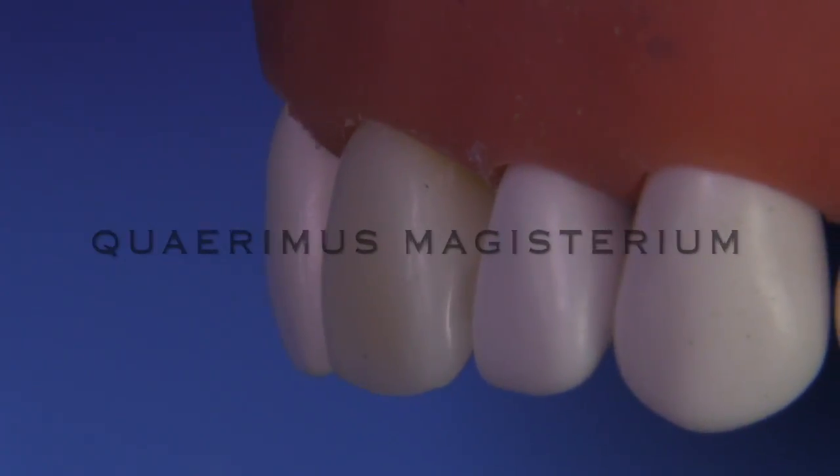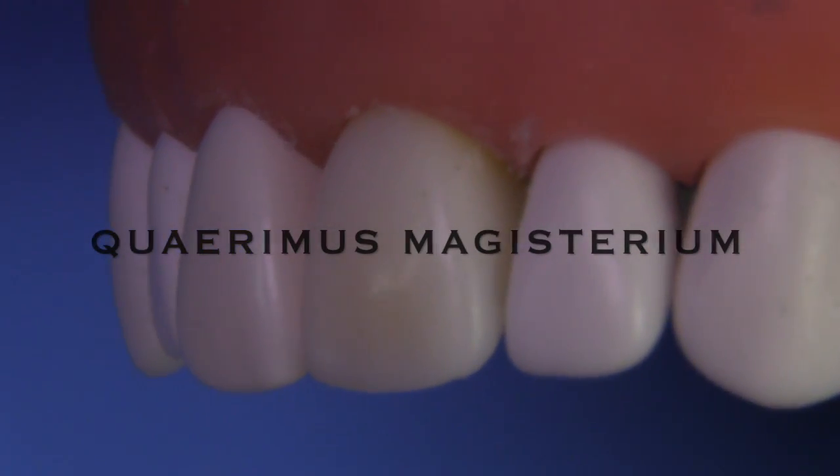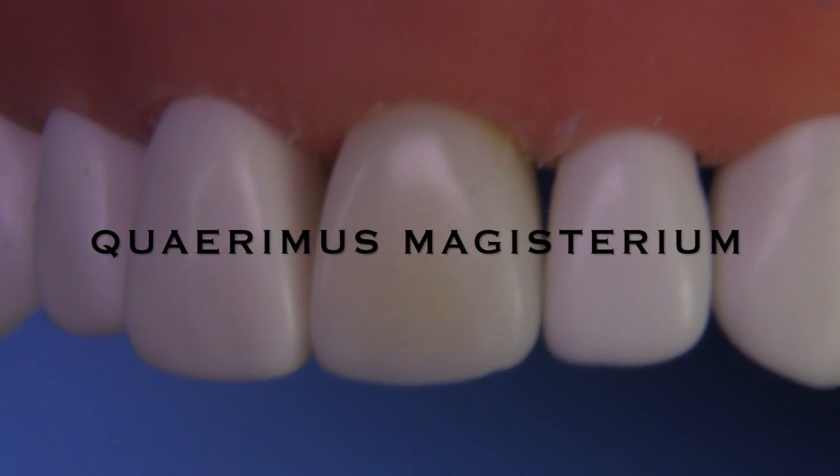You will see just a little bit of the composite. And that's it. So I hope you enjoyed this two-part video series on the class 3 composite.